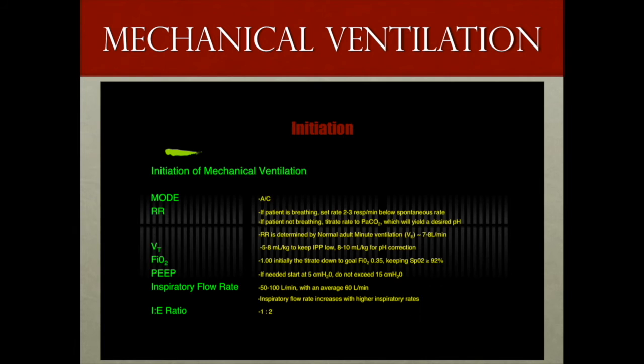So the modes in some ways can also be added to each other and mixed and matched to overcome certain issues. Moving away from modes, we need to talk about initiation, discontinuation, and maintenance of mechanical ventilation. You'll find that some institutions will have respiratory therapists that are very protocol driven and will not need initial mechanical ventilation parameters set by you. And some institutions will be very hierarchical, and the respiratory therapist will require every parameter set by you during the initiation of mechanical ventilation.